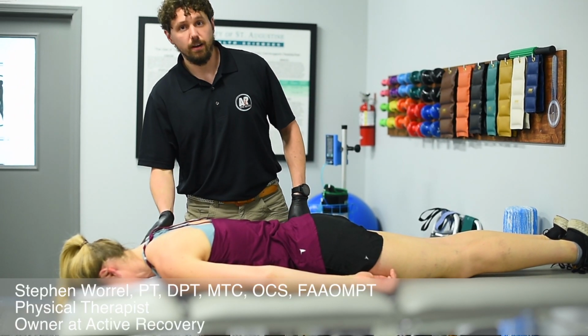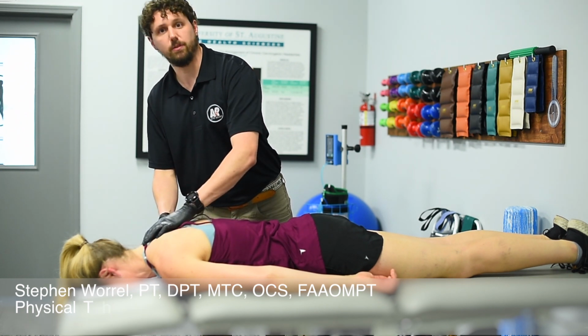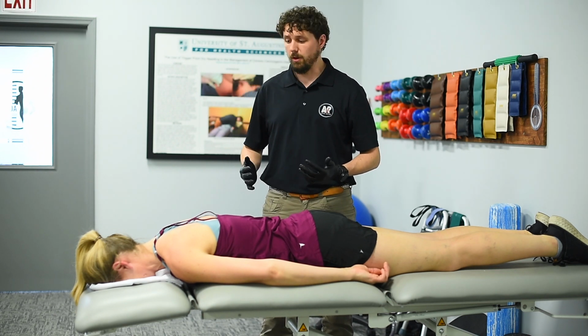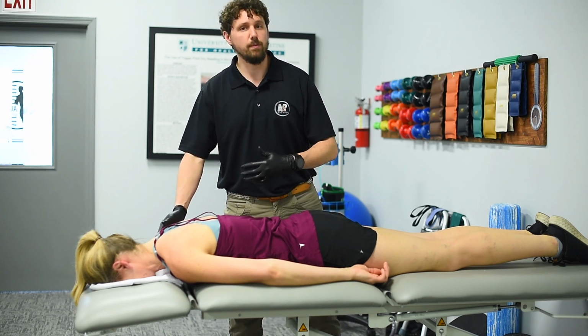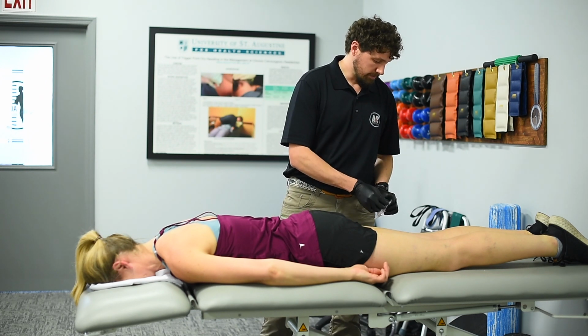Show you dry needling. I'm going to do her upper traps and right at the base of her neck here. Like we talked about before, the goal of dry needling is to loosen that muscle up, release those trigger points so that she can move a little better, maybe have a little less pain. Like I said, I use a very thin needle.